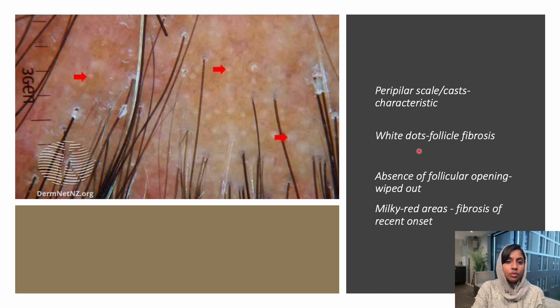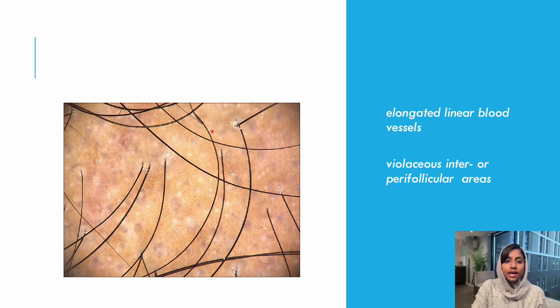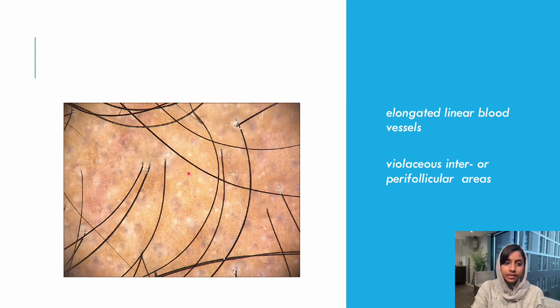You can see the white dots indicating fibrosis. In advanced cases, there will be absence of the hair follicle, indicating cicatricial alopecia. The milky red areas indicate an early phase of fibrosis. Other features include elongated linear blood vessels and violaceous inter- and perifollicular areas.